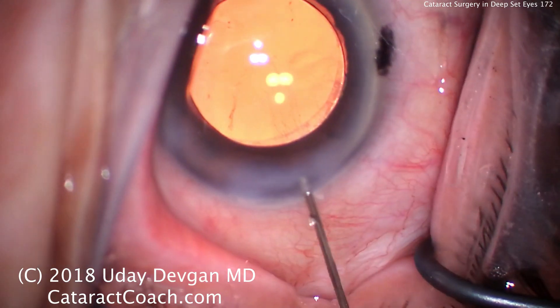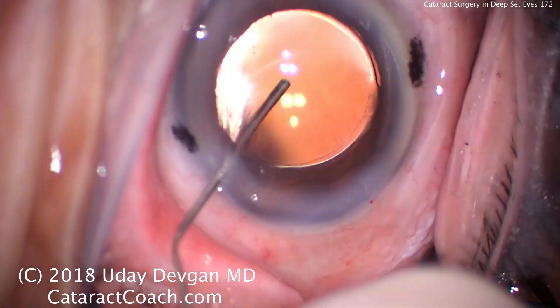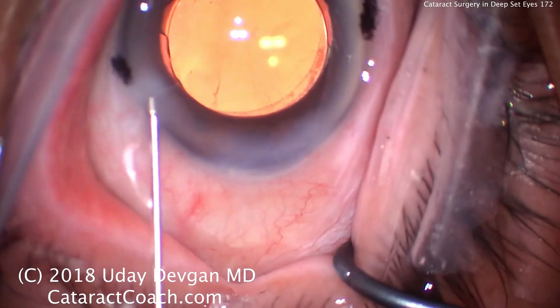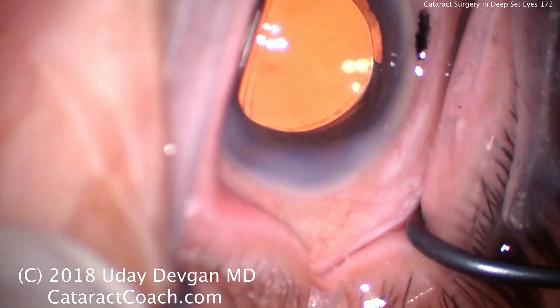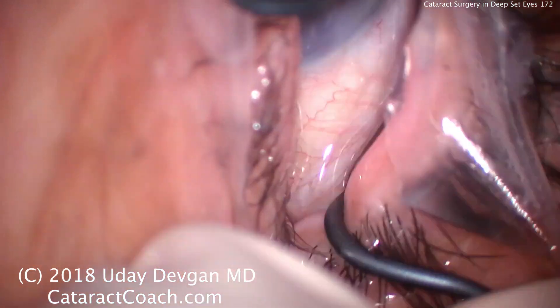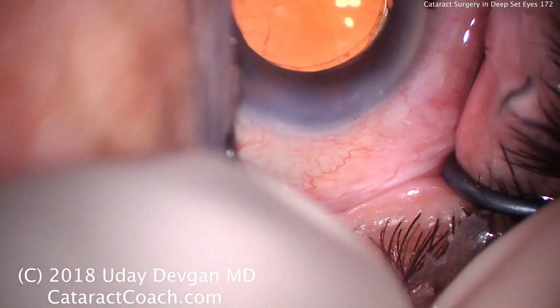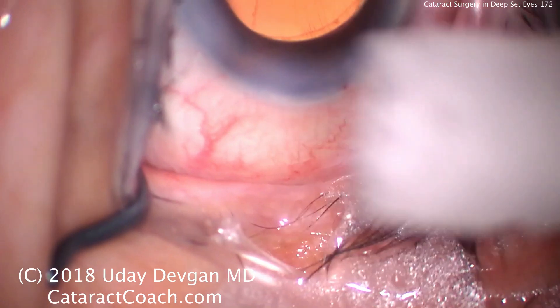We're hydrating and sealing the incisions here, and as we do this, we're going to have the entire speculum just pop out of the eye. So again, this is a challenge — these deep-set eyes are not easy. There's that speculum in the wrong position; we'll try to reposition it. This of course exposes the lid margin a little bit, which is why I waited to reposition until after we sealed the incision. And now let's just confirm that the incision is sealed.